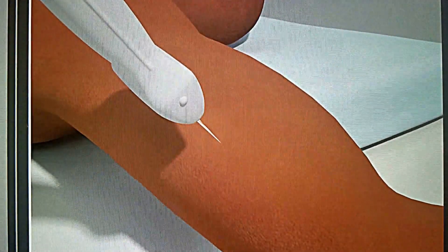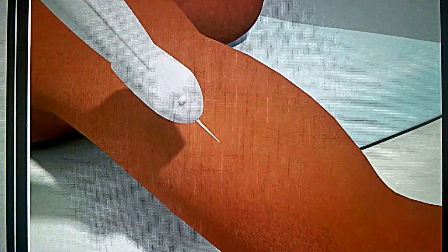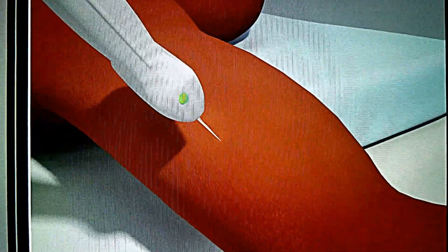The patient is in a supine position with the arm extended 90 degrees at the patient's side and externally rotated.